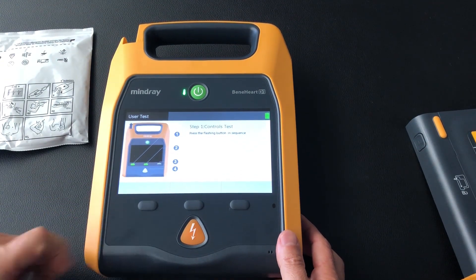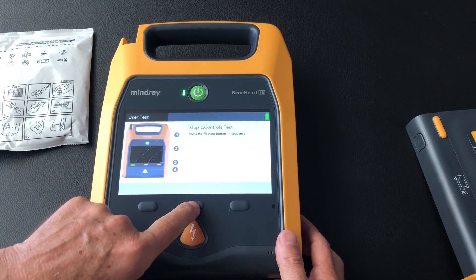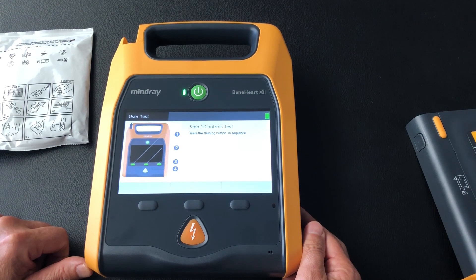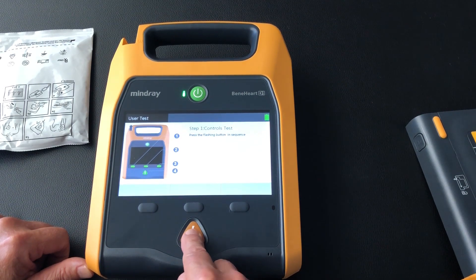It's telling us to press this button, then this button — the little green light's flashing — then this button, and then the zap button.